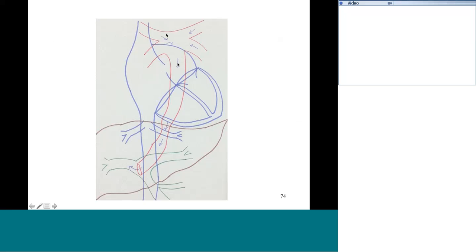So this is the cartoon of all the four pulmonary veins draining into the portal vein. So there is an obligatory obstruction at the liver parenchyma. The blood has to go through the entire hepatic sinusoid and then come back into the hepatic vein. Rarely you will have a direct communication between the portal veins and the hepatic vein through the ductus venosus, and in such patients, if you treat them with prostaglandin, suddenly there will be an improvement. The pulmonary venous obstruction will be relieved and they will open up.